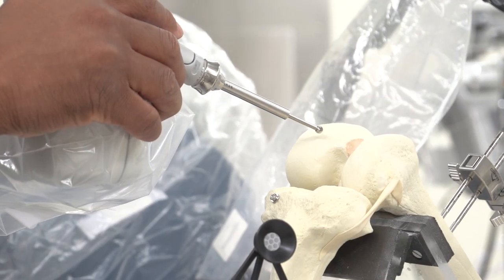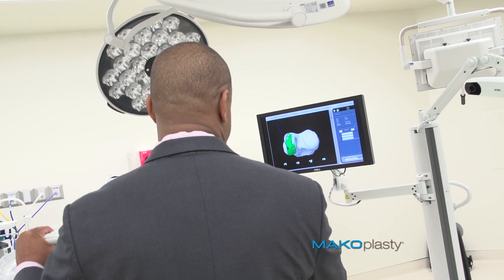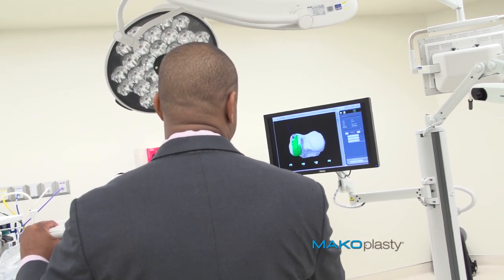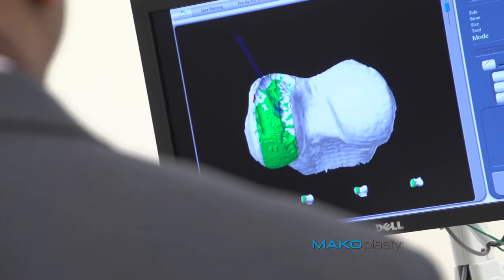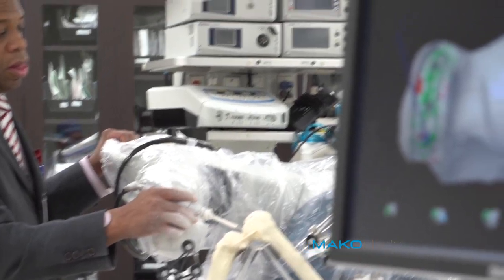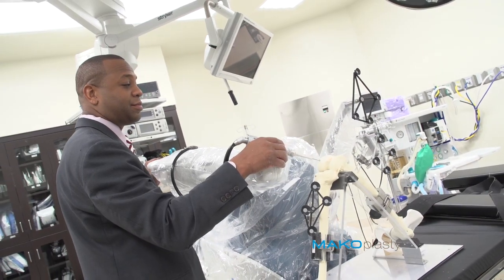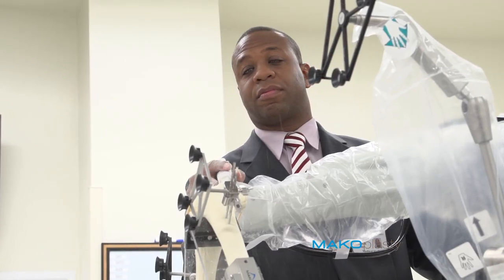I can slowly chisel away the bone that's necessary. When I look at the screen, the green data tells me the extra bone that I must remove. What's critical is this robot will not allow me to go outside of the plan we've instituted at the very beginning of surgery. The surgeon is actually still doing the surgery — the robot is just allowing the surgeon to do it in a more precise manner, because the robot will not let me deviate from the plan.